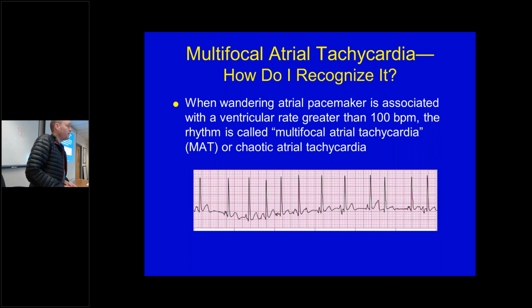yes, if you see a P wave with different morphology and it's beating, and then you get regular, then you would say sinus rhythm with intermittent PACs. It might be in a pattern, bigeminy, trigeminy, but you're only going to see those two different kinds of P waves, right? And you're going to be able to recognize it. This looks like a normal complex. This is a different complex. And then you can recognize each time that different complex is beating, right?